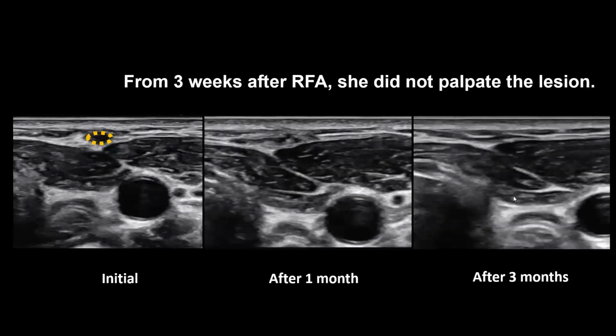3 weeks following ablation, she could not palpate the lesion. A month after ablation, the lesion turned to a little hypoechoic lesion on ultrasound, and 3 months later, it vanished entirely. She was quite happy with the treatment she received.